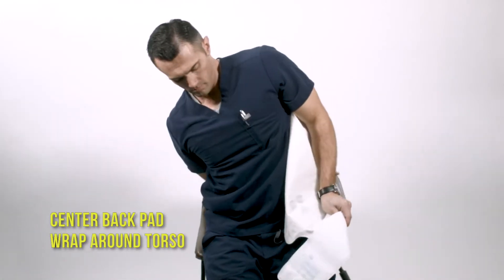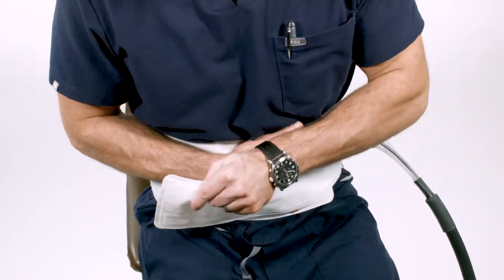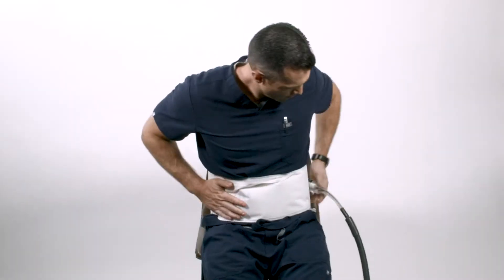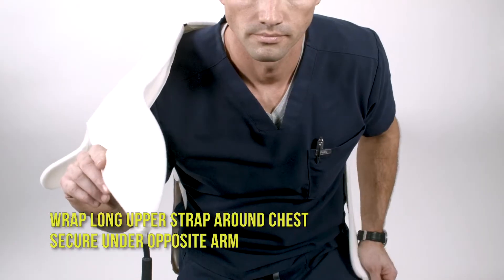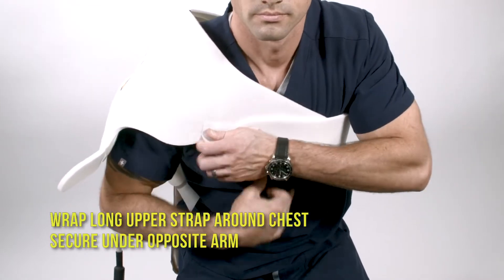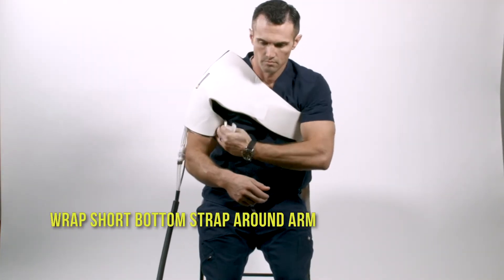Secure under the opposite arm. Wrap the short bottom strap around the arm.